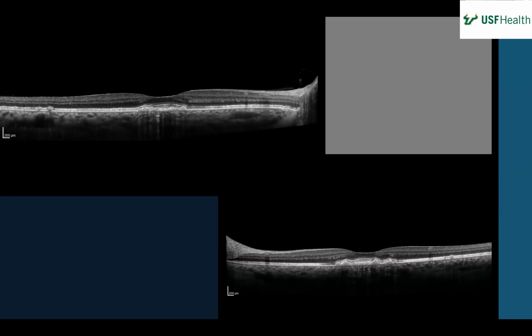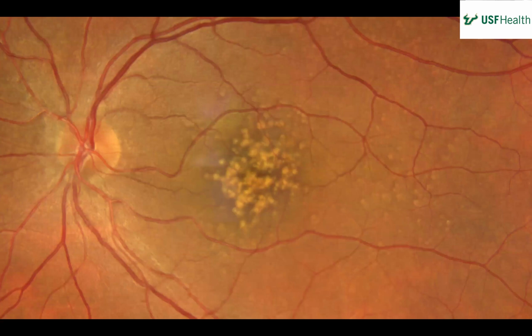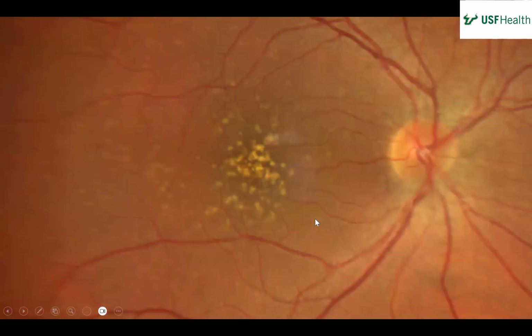Me as well. Yeah. And actually on the color, one of the things about the pattern, because we sometimes do get into patterns of drusen. Like, are they radiating linearly outward? And I don't know that these really are. What's the previous? I thought in this one maybe they were kind of, active imagination. Yeah, but I think it's just spots. Yeah, I think it's just random.